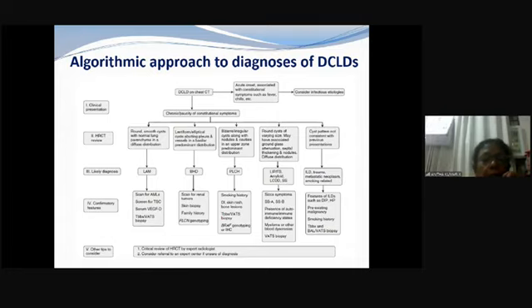The typical shapes we said: smooth round cysts would suggest LAM, lentiform or elliptical would suggest Birt-Hogg-Dubé, bizarre shaped PLCH, and round cysts of varying size associated with ground glass, think of LIP. And then you do the confirmatory tests which I have described, and then you can come to a safe diagnosis.